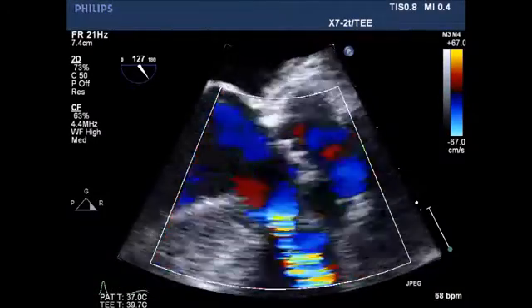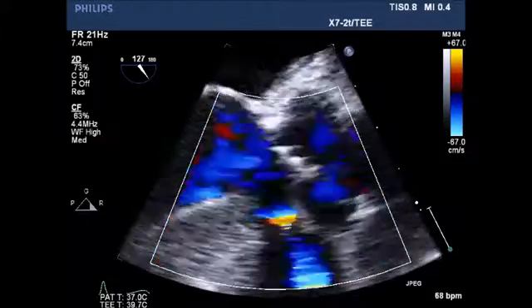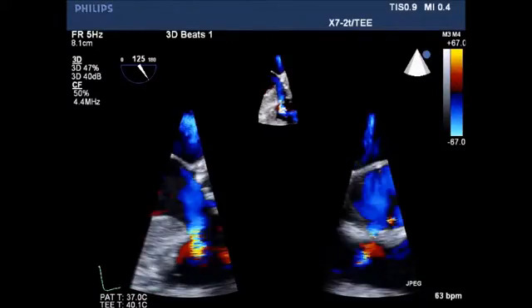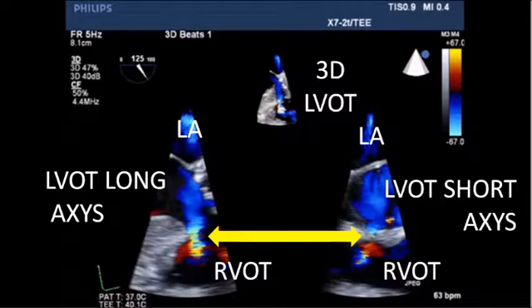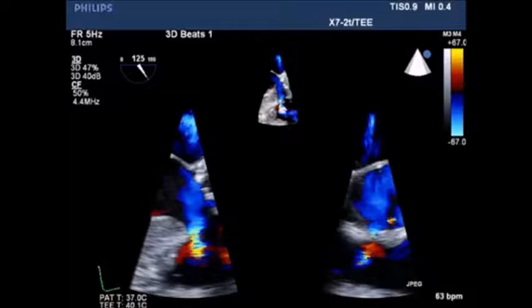Zoomed view of the ventricular septal defect, followed by 3D imaging with long axis of the left ventricular outflow tract on the left and short axis on the right, demonstrating this subvalvular defect. Color Doppler clearly demonstrates the defect.